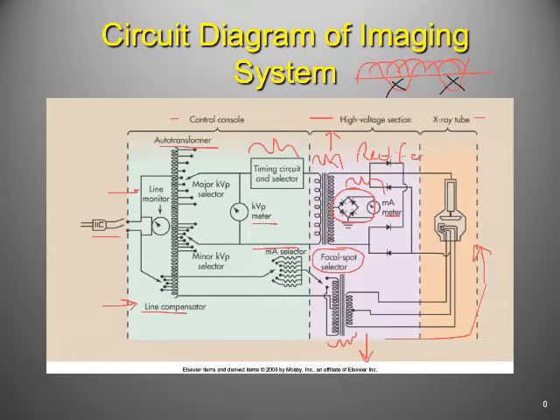So I said the timing circuit though. So the time part of it is how long is that going to be energized? Because that's going to be what determines the amount of electrons that jump across, is how much time I've given it this potential. So when the time stops, the potential stops also. So the electrons jumping stops. Okay? Now, I just told you a whole lot of weird sounding stuff, right? We are going to drill this down today. Okay? So I'm going to move forward, but it's not going away.